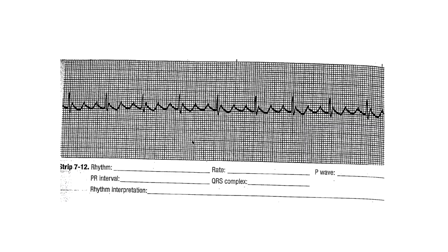In this rhythm, the ventricular rate is regular, so we can use the small box conversion table - that gives a rate of 79. The flutter waves are at a rate of 237.